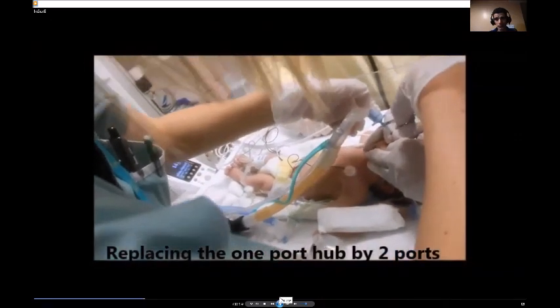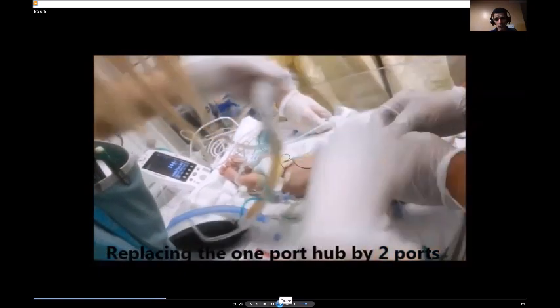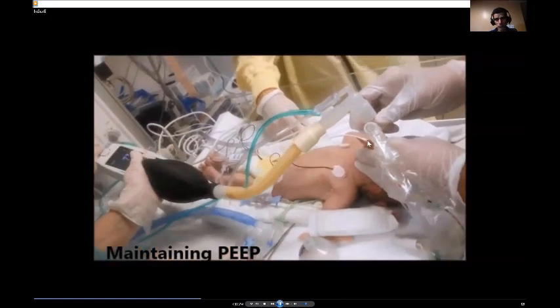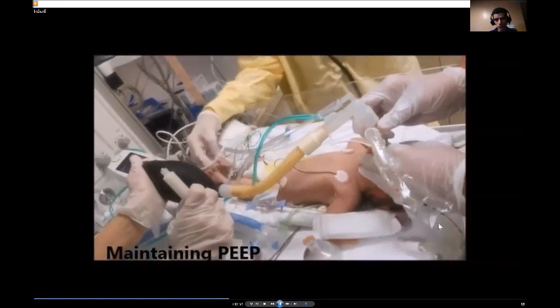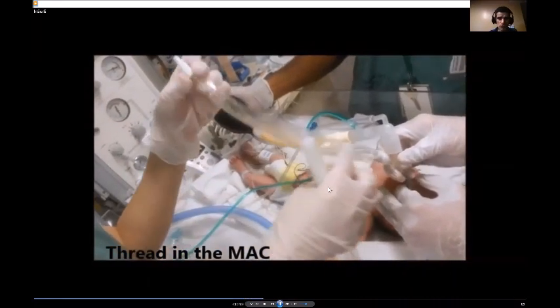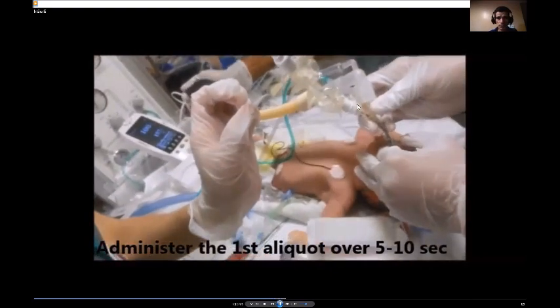The respiratory therapist is disconnecting the port of the ETT and connecting another port which has two ports — one for ventilation and the other for inserting the MAC catheter. The catheter is inside a closed system to prevent contamination with the exterior prior to insertion.